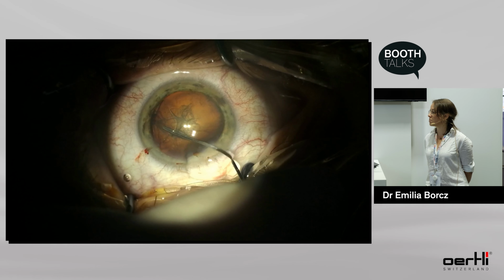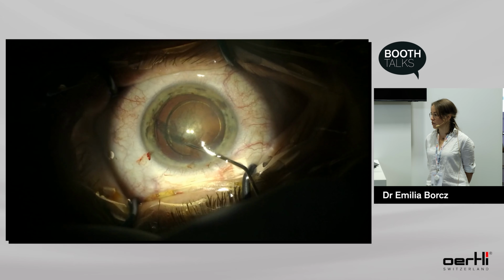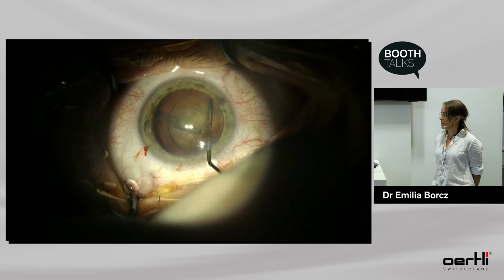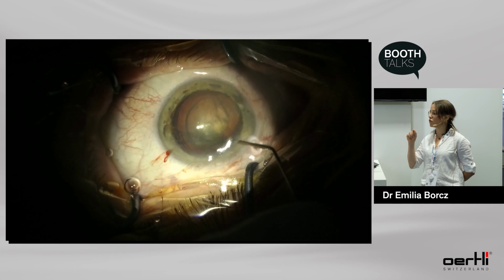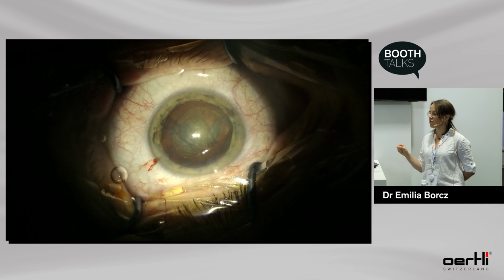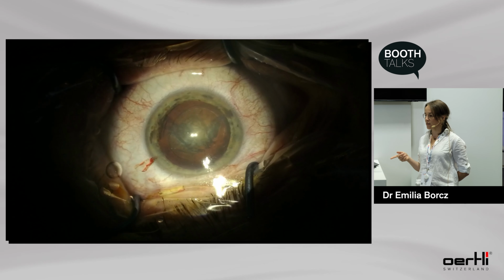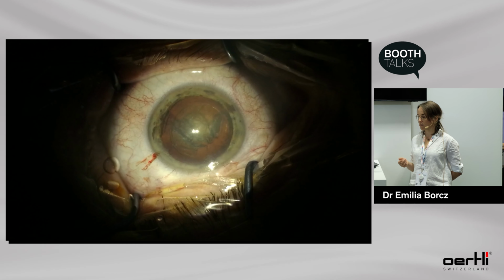Here I perform a precise hydrodissection, and after that hydrodelineation, which gives us the golden sign. Later, in a few seconds, you will see how I add a little bit more fluid into the central part. Just a second. Okay, now you can see it. Just in case I will not be able to perform phaco chop, because this one is very soft, you will see why it's very helpful.